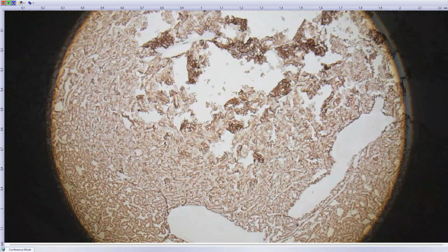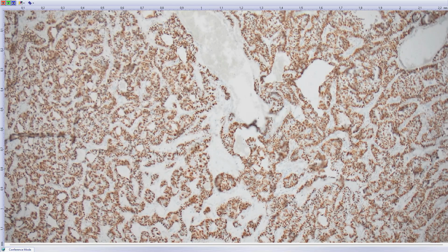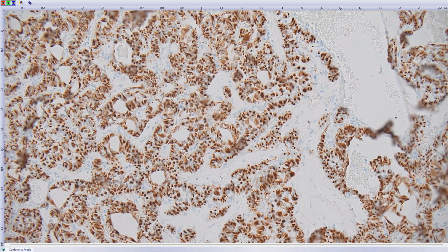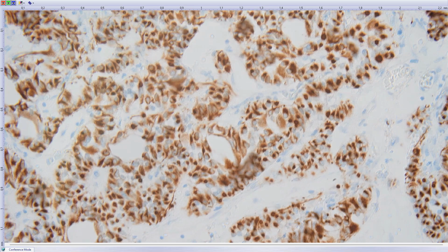And in contrast to regular paraganglioma, you have this diffuse cytokeratin immunoexpression, and this immunoexpression shows this very interesting dot-like positivity.